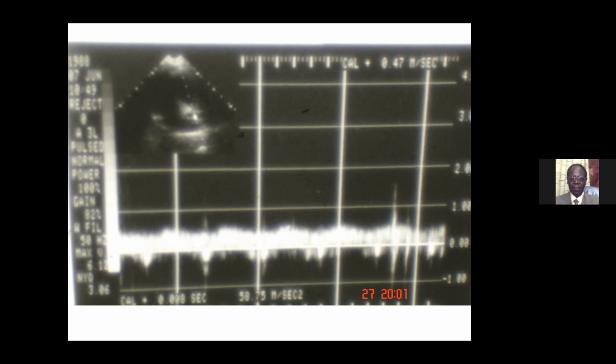And therefore, intra-abdominal pressure increases, and the diaphragm squeezes the liver. Since it is the largest organ in the abdomen, that will feel the pressure. So in the hepatic veins, the pressure will rise on inspiration and go down in expiration. That explains why it is undulating. It is the only vein in the body that undulates like that. So this is a characteristic, a hallmark of the hepatic vein.